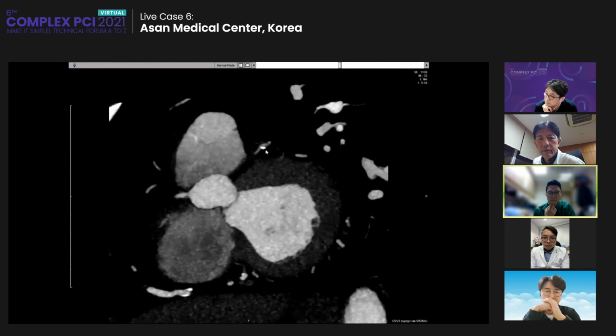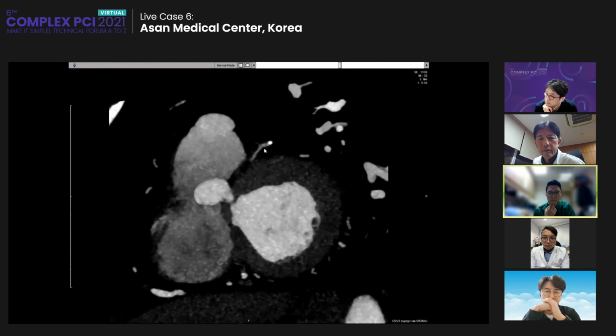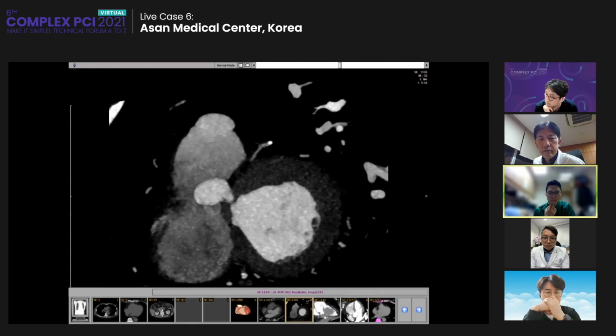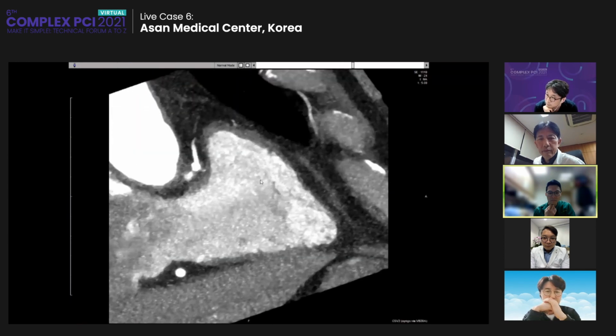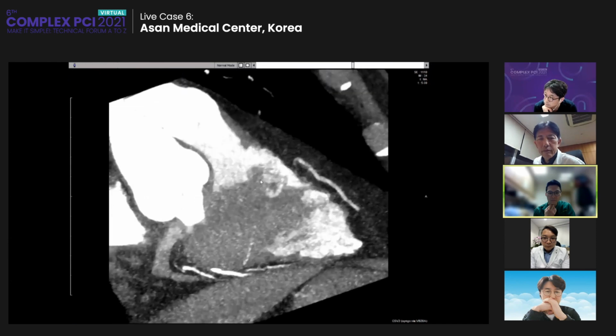Now the bad portion is that there is a bifurcation at the distal cap, which is a big septal, and we have already observed this morphology through the angiogram. Now this is a long axis view, which is quite similar to the RAO cranial view of the angiogram.